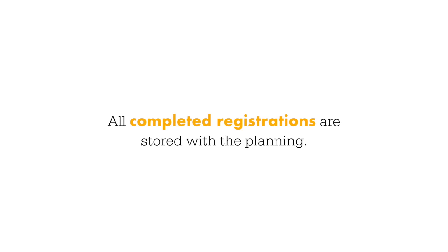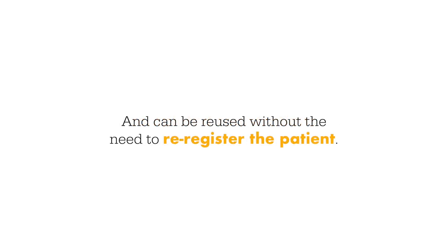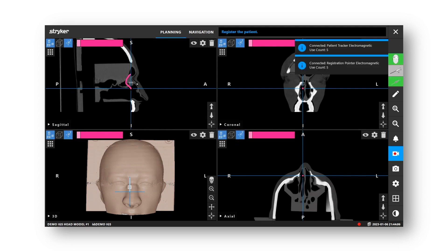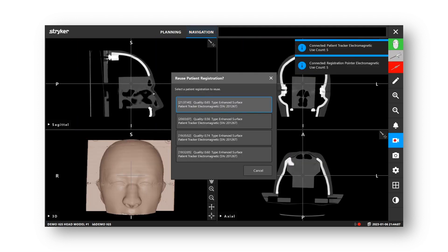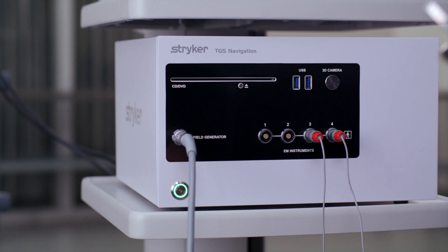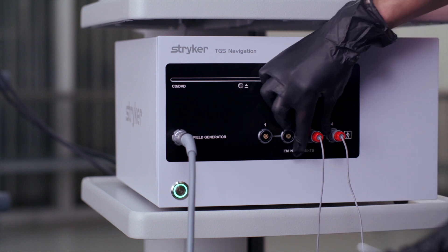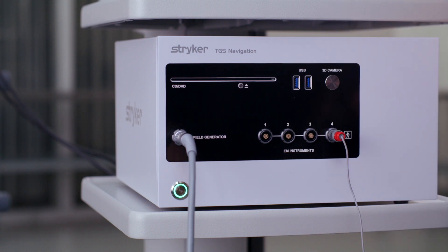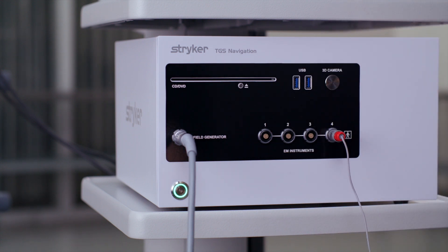All completed registrations are stored with the planning and can be reused without the need to re-register the patient. To re-use a previous registration, ensure you are in planning mode. Press and hold the left mouse button on the navigation tab until the re-use patient registration dialog box appears and select the registration you would like to use. After registration, you can remove your registration pointer to free up a port for other instrumentation.